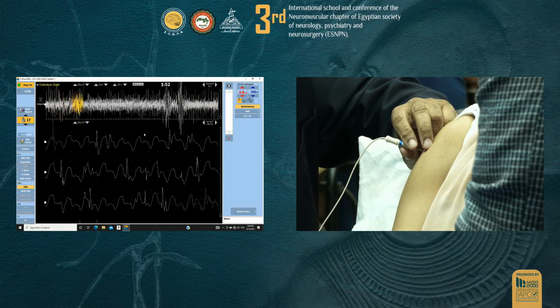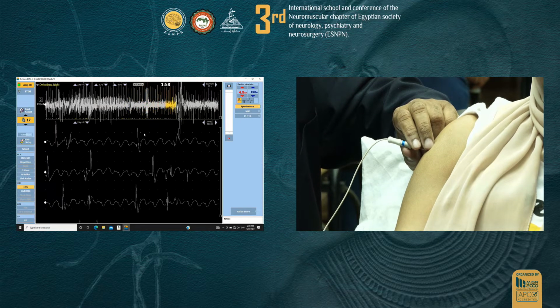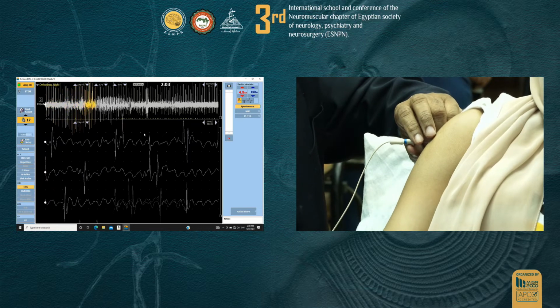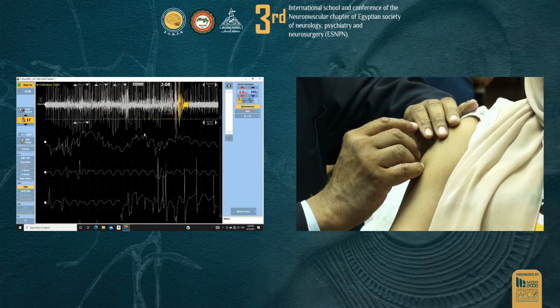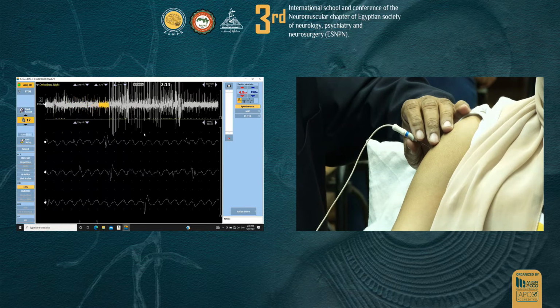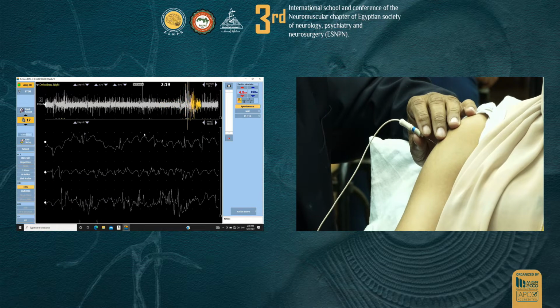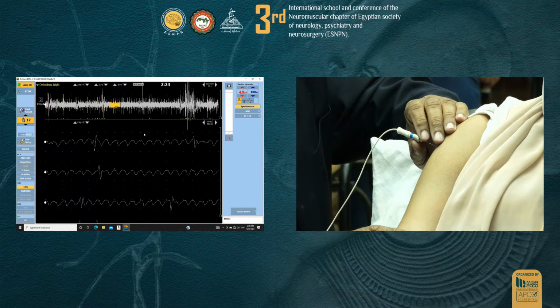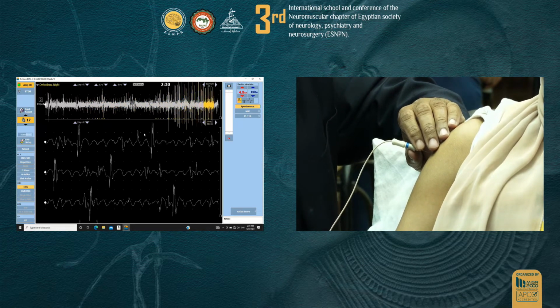There, you can only see a motor unit. Just relax. By just looking at it and hearing it, it's a motor unit. I'll tell you why, but I want to get a smooth baseline. Just relax. Let go. Yeah, she is stressed out. Just drop your shoulders. Relax. So anyway, I wanted to show you a flat baseline, resting. You can see the motor unit is not resting, and I just put it up. Yeah, still. Let go. You got to drop your hand. Good. I'll pick another muscle if I can't get into this one.